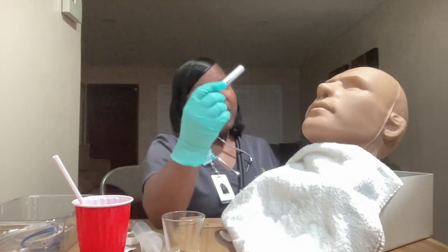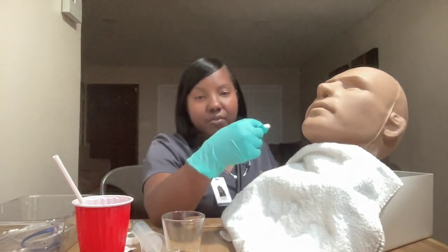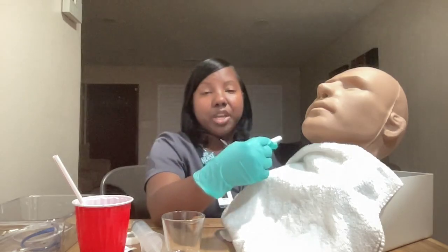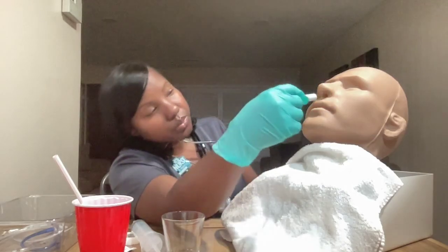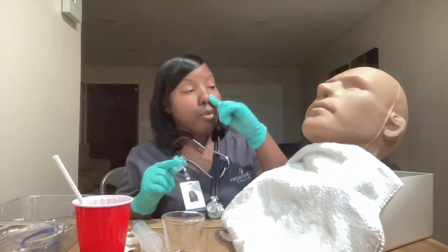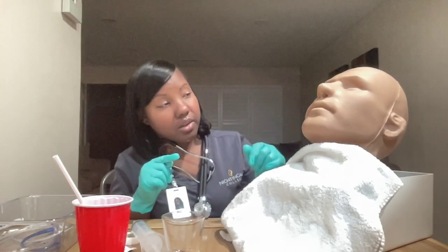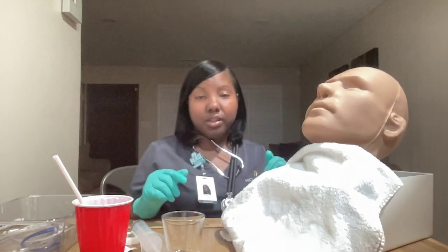Ms. Jones, I am now going to shine this light on your nose to examine each nare. I'm checking for any obstruction or deformities, looking at the membranes, and ensuring there's no redness or swelling. Everything looks okay. Next, Ms. Jones, I'd like you to hold one nostril and breathe in and out of the opposite one, then switch. It appears Ms. Jones has the greatest airflow from her left nostril, so that is the nostril I'll use for insertion.